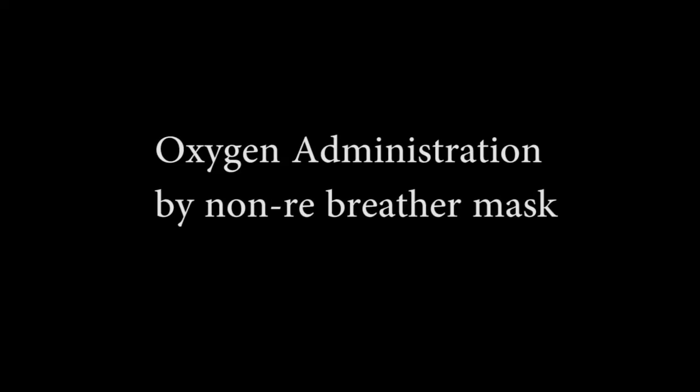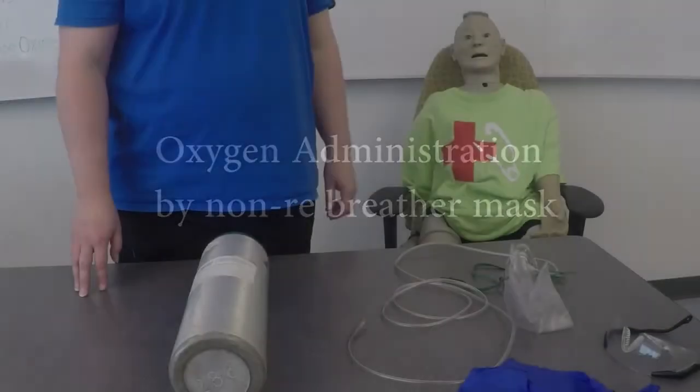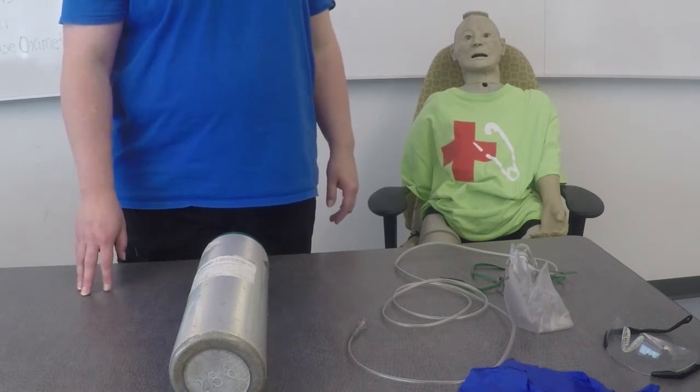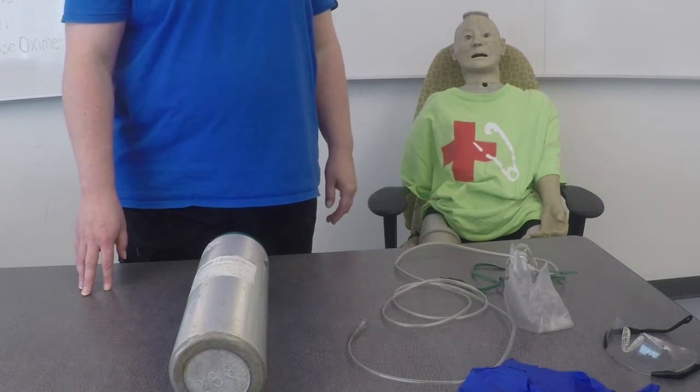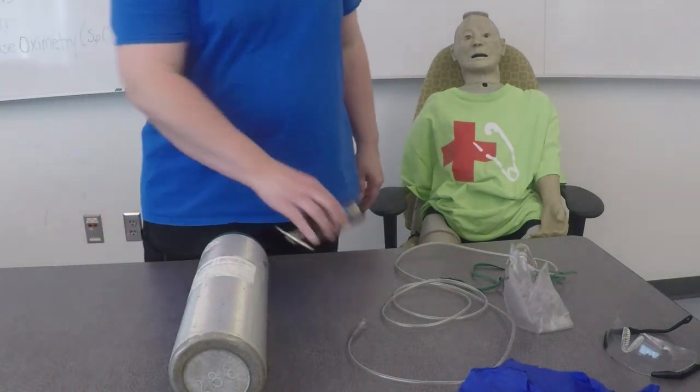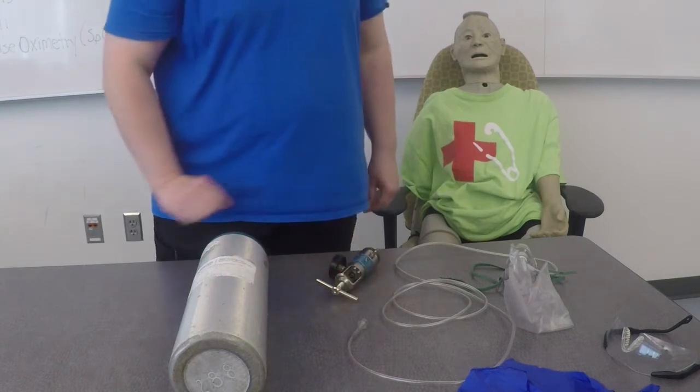This is oxygen administration by non-rebreather mask. This skill is designed to evaluate your ability to provide supplemental oxygen administration by non-rebreather mask to an adult patient. The patient has no other associated injuries. This is a non-trauma situation and cervical precautions are not necessary. You will be required to assemble an oxygen tank and a regulator, then administer oxygen to an adult patient using a non-rebreather mask.